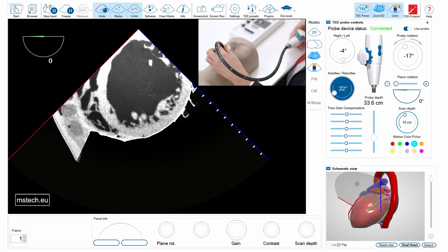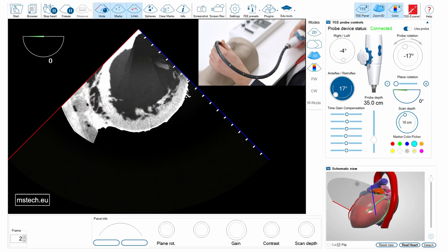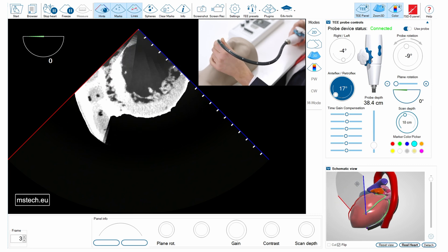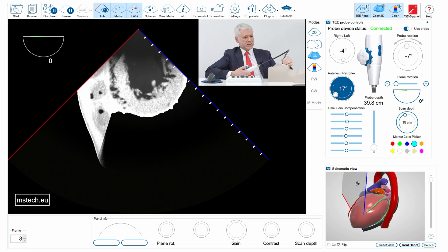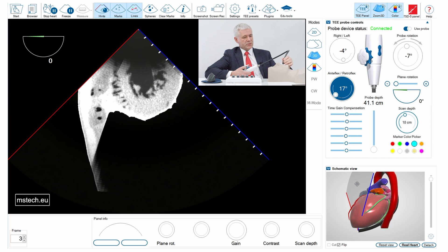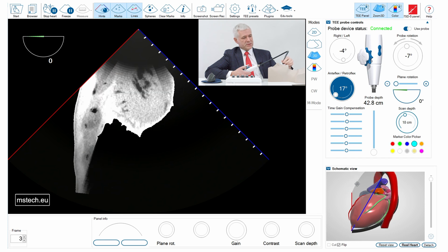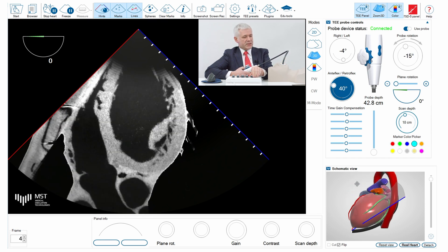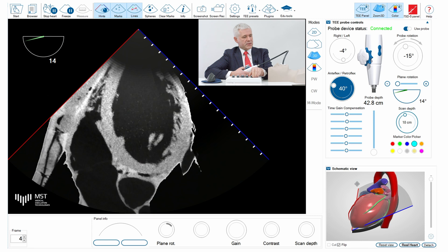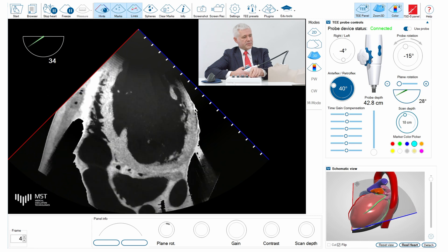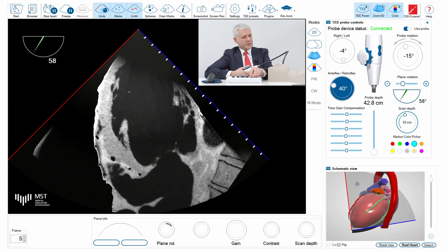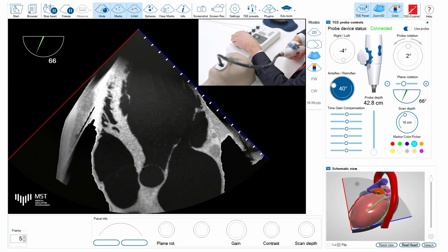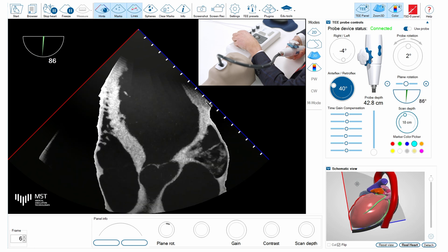Now I'm moving towards the lower or very deep transesophageal views and you can see how I can obtain the view of the aortic valve in this case — in a moment, I hope I will do it — yes.